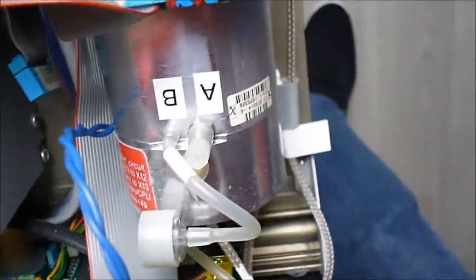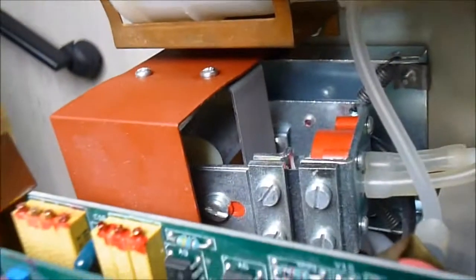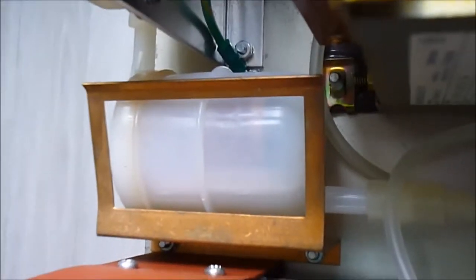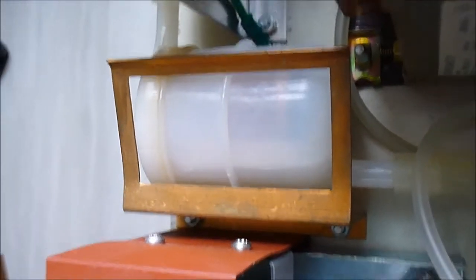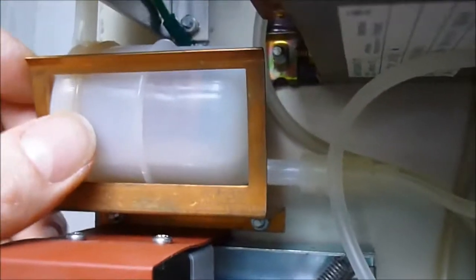Here you have the motherboard. And the pump assembly here, with some filter stuff here, in this can. This is an aluminum, copper piece. This also. So, spare, no response obviously.